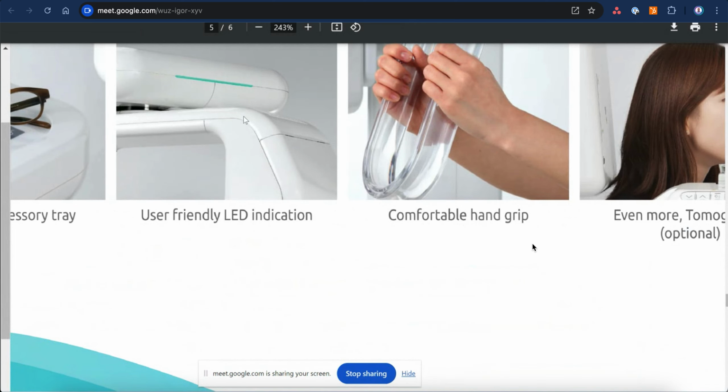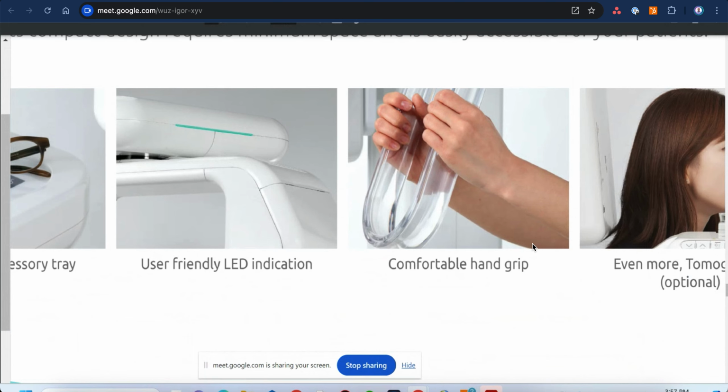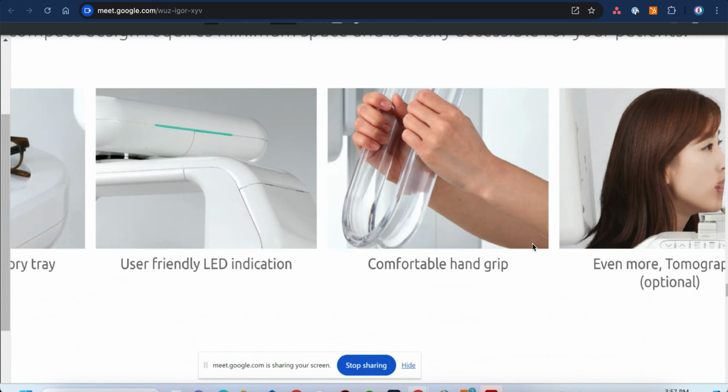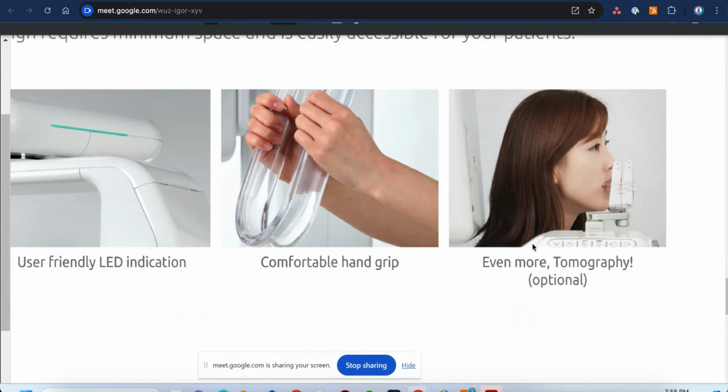This is the lead indication, like you should stand here and straighten your back, for example, so it can help me to position you exactly. This is where you can put your hands, I showed you above, and this is where you can put your chin. This is the handy grip. Yes. So you're fixed.